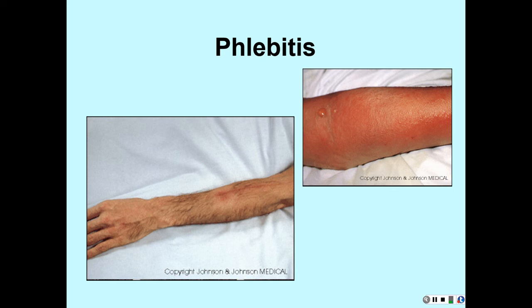Now, your patient may get some IV therapy or some IV antibiotics or something like that, that you're going to need an order for. But we don't usually call the physician and say, hey, I'm restarting the IV because they've got some phlebitis. If you're that concerned about it, then you need to call them, okay?